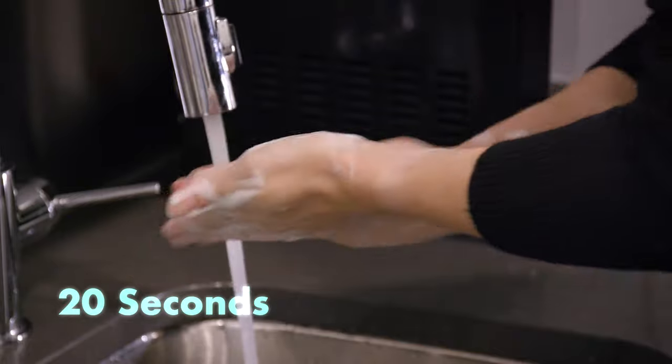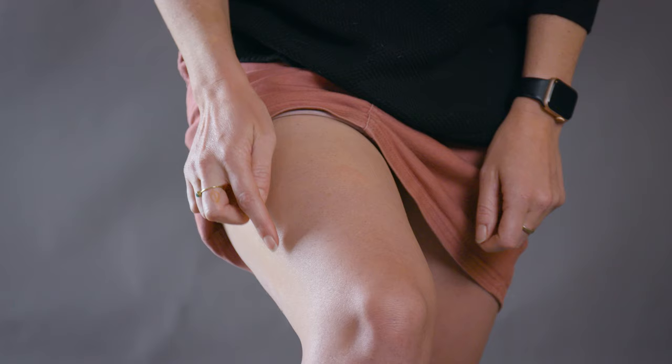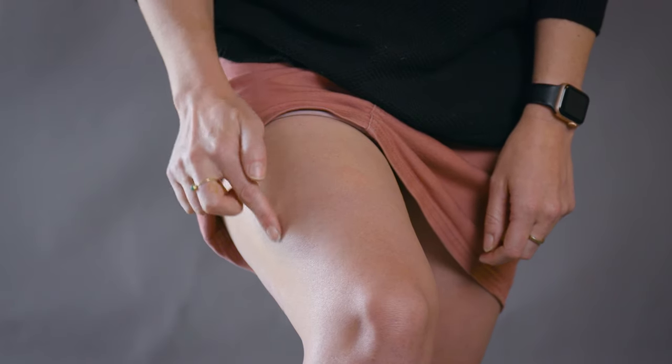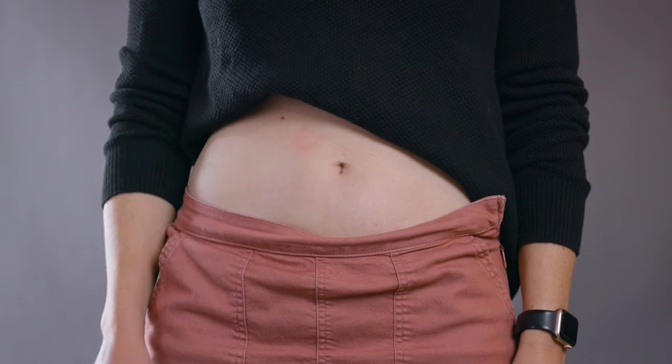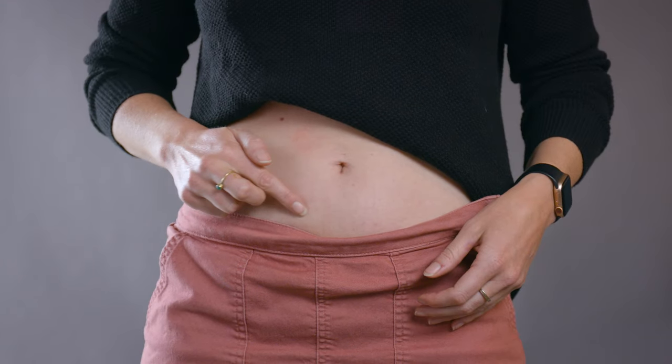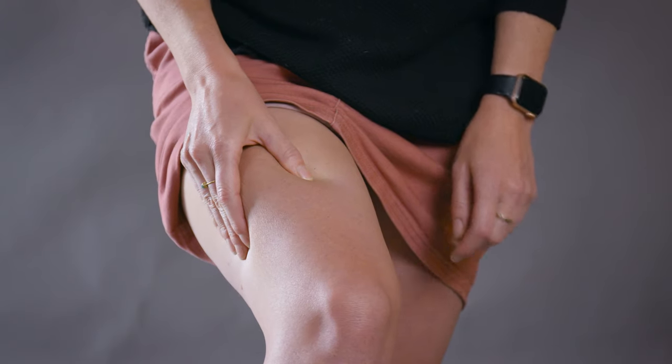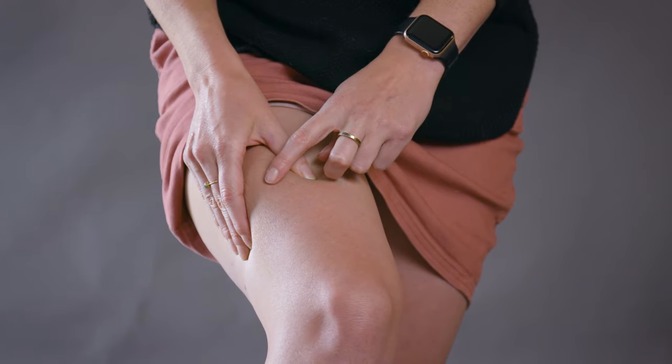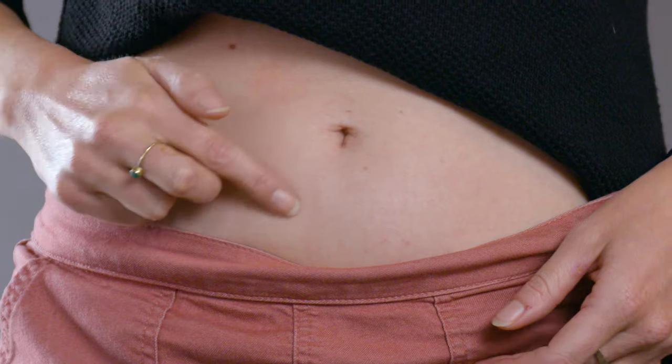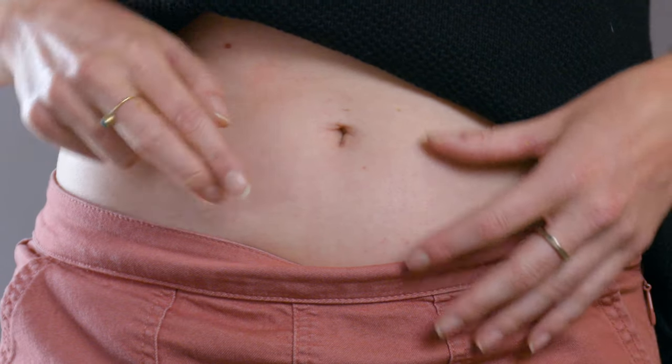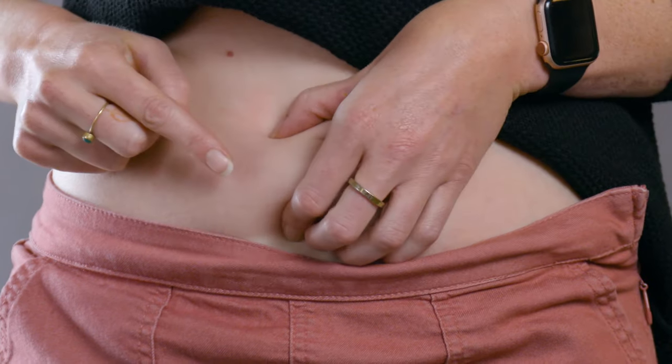Next, you will choose the area of your body for the injection. You may use either your thigh or your stomach. The area that you pick should not have any scars, moles, or tattoos. It's important to avoid any area that feels bony, and if you use your stomach, make sure that your injection site is at least two inches from your belly button.